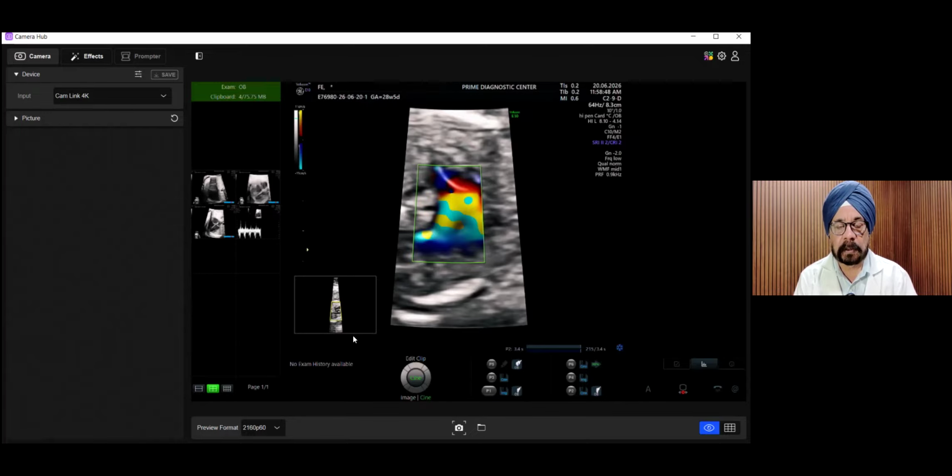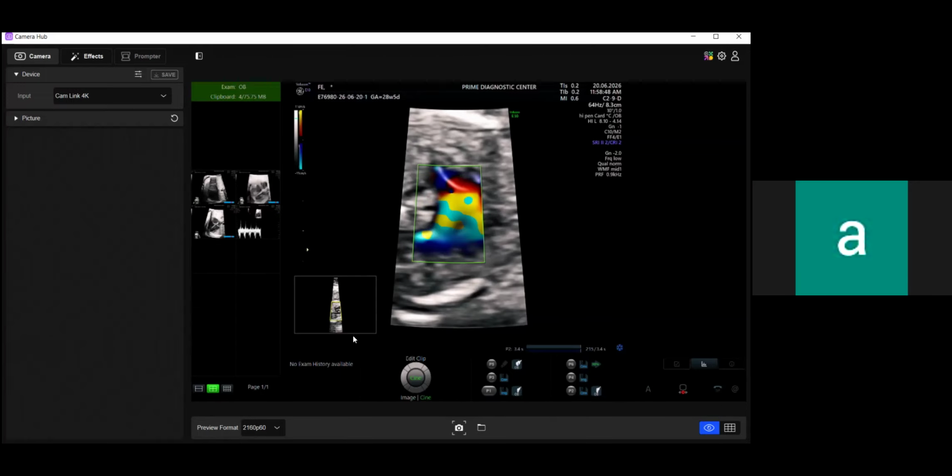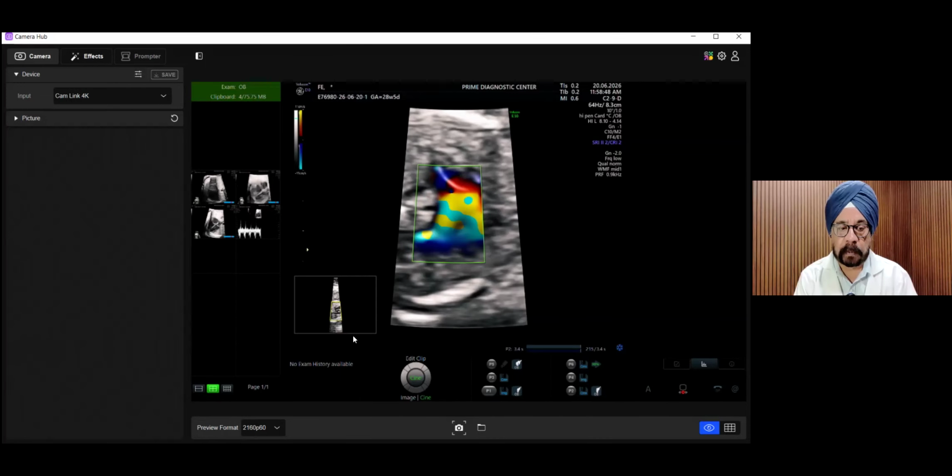You can go to my YouTube channel, and there is one video on Scimitar syndrome in fetus, and you can see how we angle our probe to look for the right pulmonary vein entering into the IVC, and the right pulmonary vein normally entering into the left atrium.